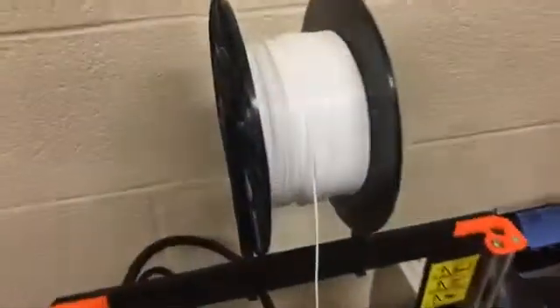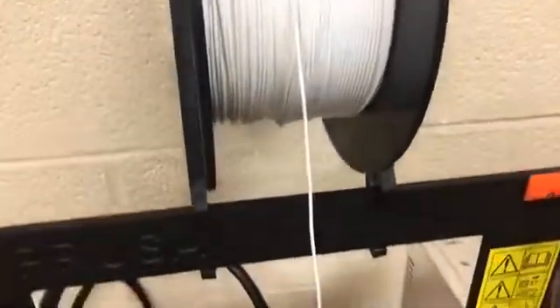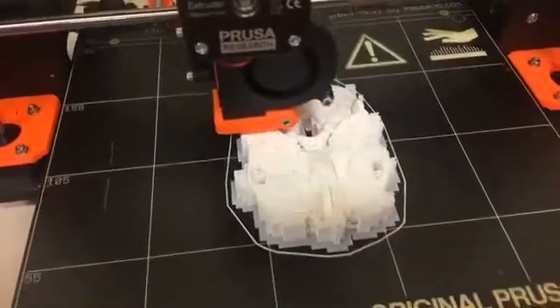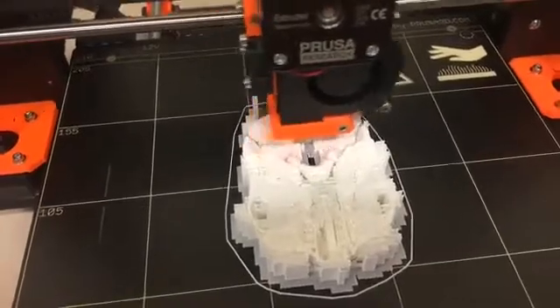And it's cool how you can see the plastic just going right into it. Yeah, that plastic's actually PLA. We do a lot of our printing with PLA. It's a fairly easy plastic to work with. It goes through the orange and black parts that are moving around, melts the plastic, and lays it down layer by layer. As it does that, it's building the model one layer at a time.